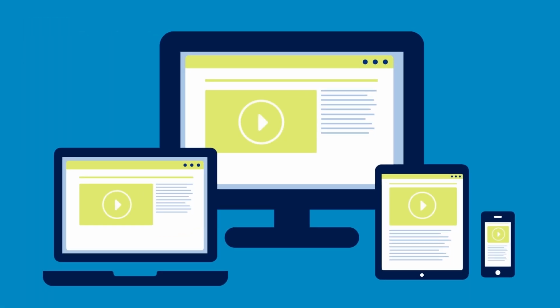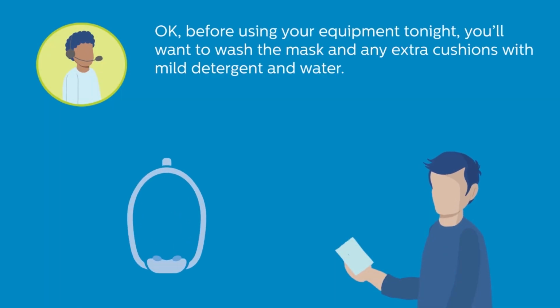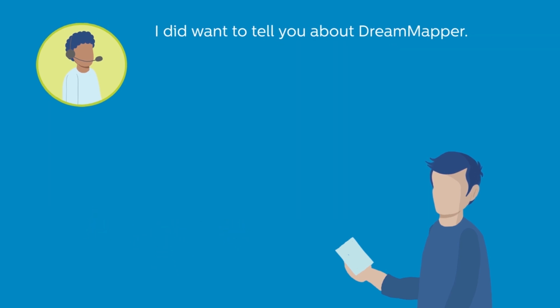Can I ask, have you watched the online videos that Philips created? I did. They were very helpful. Okay. Before using your equipment tonight, you'll want to wash the mask and any extra cushions with mild detergent and water. Also, your humidifier requires distilled water, so you'll want to pick that up before using your PAP device. Okay, got it. I did want to tell you about Dream Mapper.